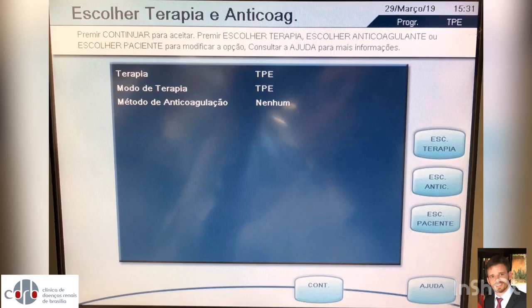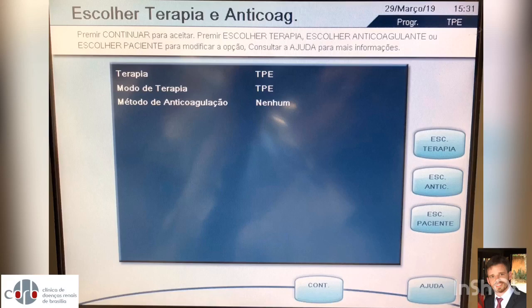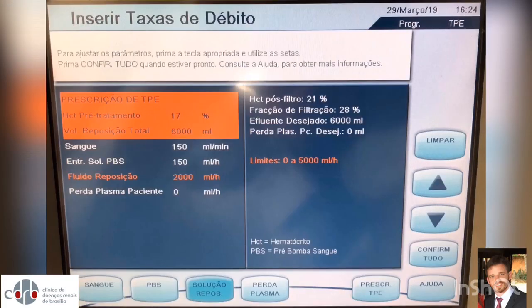When selecting no anticoagulation, the machine is disabled to use the heparin syringe. However, you are allowed to use the side pump or no anticoagulation at all.